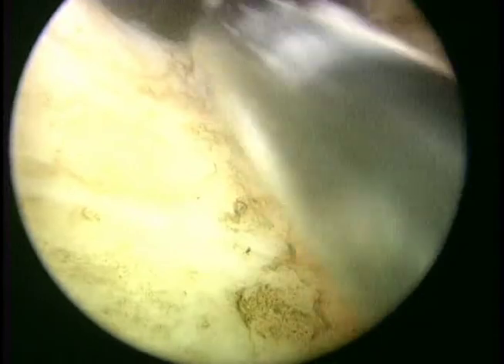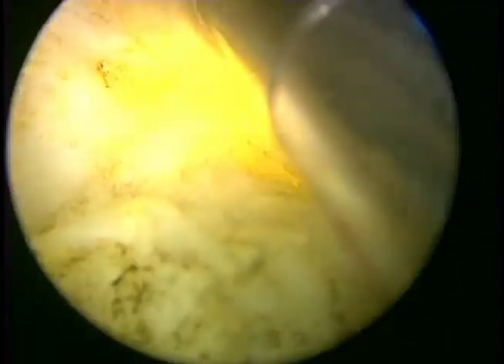Typically, the undertreated areas are the mid to apical tissues, and that is where a lot of surgeons are afraid of causing incontinence and thereby do not fully resect the transition zone in those areas. At this point, we can quite nicely see that we've gotten down to the surgical capsule. We see the small little stones just proximal to the verumontanum, and we're taking down this groove between 7 and 6 o'clock and start moving our way, undermining the floor adenoma.